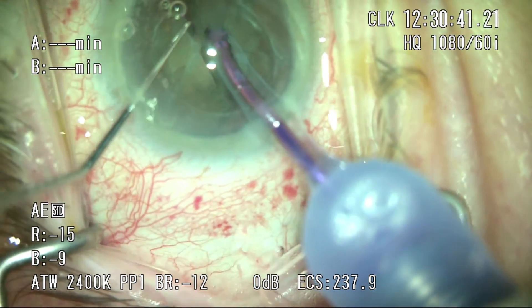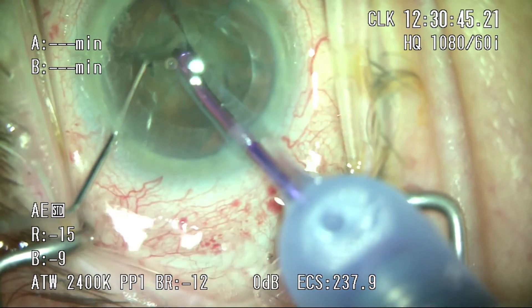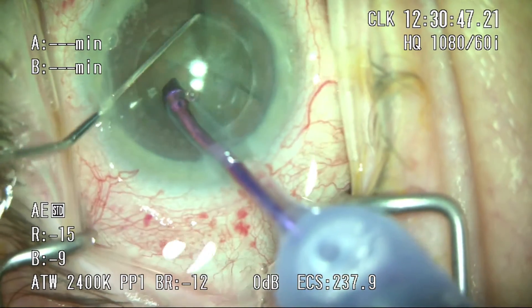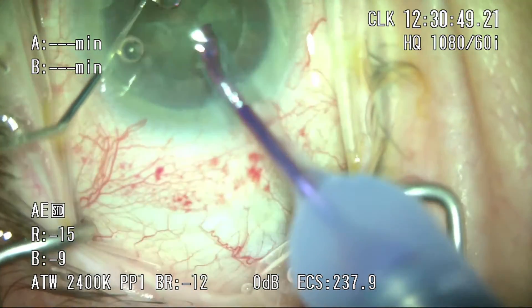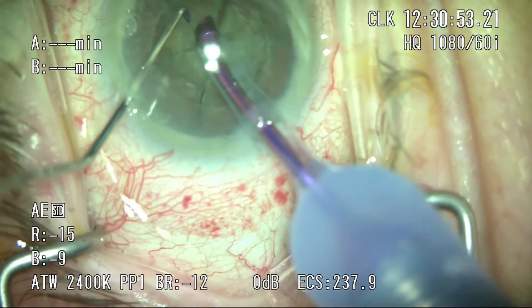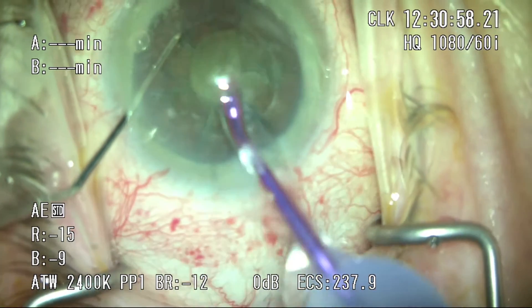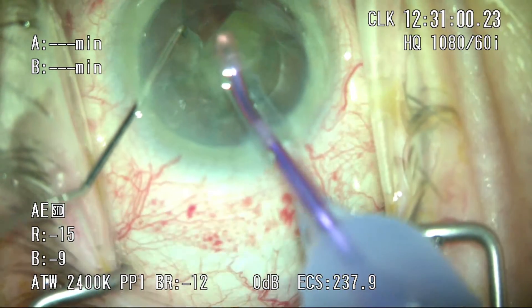I'm going to go around for illustrative purposes and break up each one of these pieces. This is a fairly dense lens, about a plus-two to plus-three. You can really see the substance of the lens, but also how cleanly the Femto has cut up the pieces. Finally, I'm going to bring one piece up into the anterior chamber and start with evacuation.